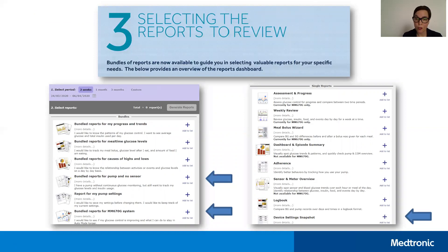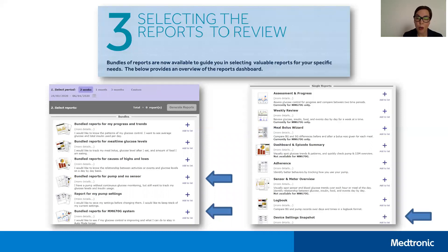Once you have uploaded all of your data and that is complete, you'll want to go back to your homepage in CareLink and click on the Reports tab. Here you'll be presented with all of the bundles of reports, the single reports, and the daily reports. This can sometimes feel overwhelming your first time, and this is normal. We always suggest that you start with one or two reports at a time. I've outlined the bundle you might want to look at if you have pump data but no continuous glucose monitoring data, and also the bundle you might look at if you are using pump and CGM and potentially auto mode.